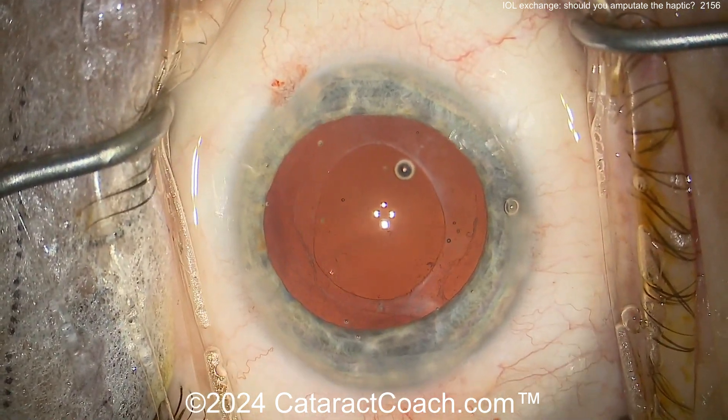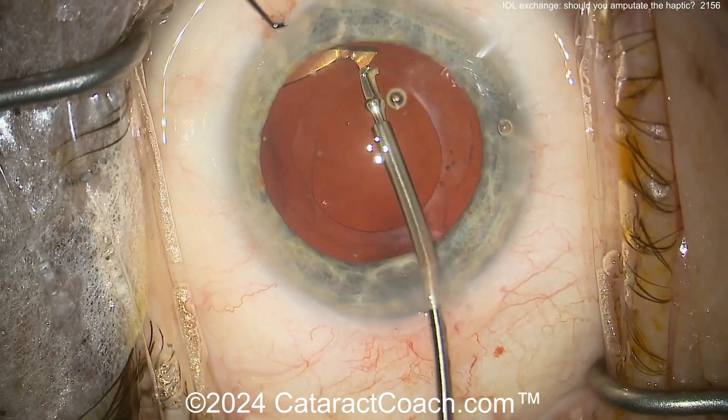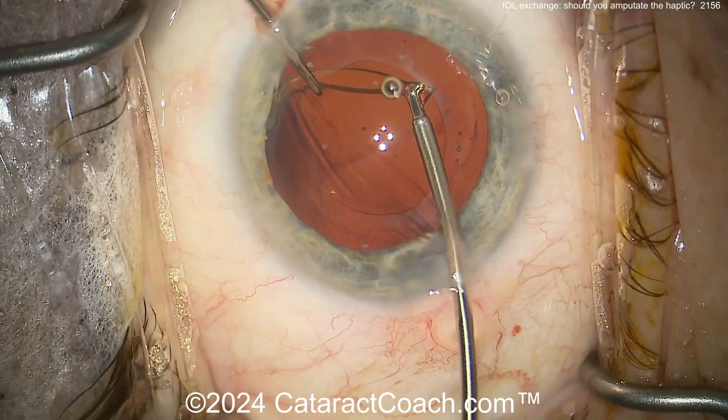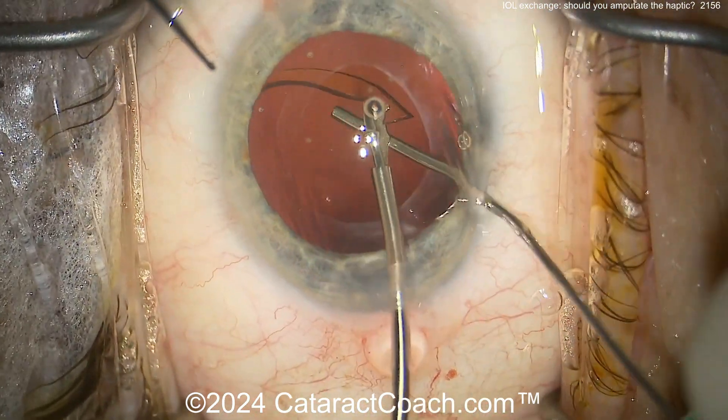Pull one half — the other half is still kind of attached for a little bit, and then it'll come out too. Now, there's that haptic. You don't want it rattling around inside the eye. But you're pulling on the zonular support there.